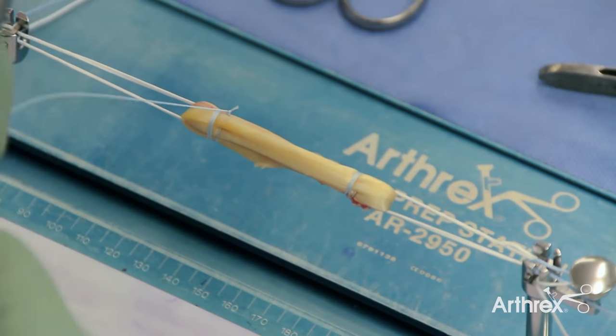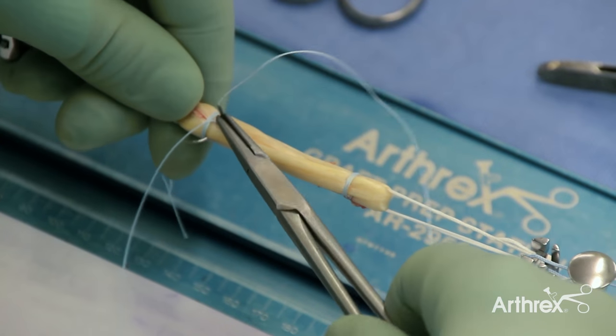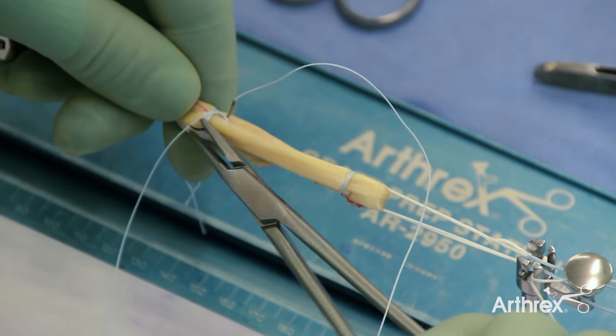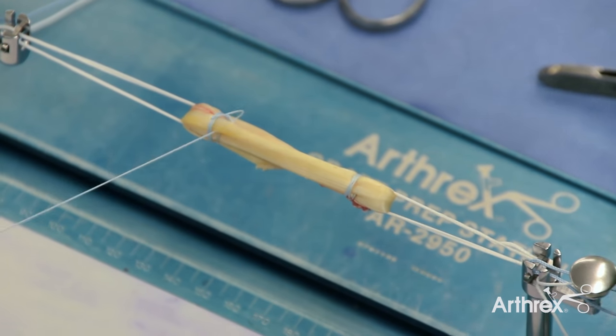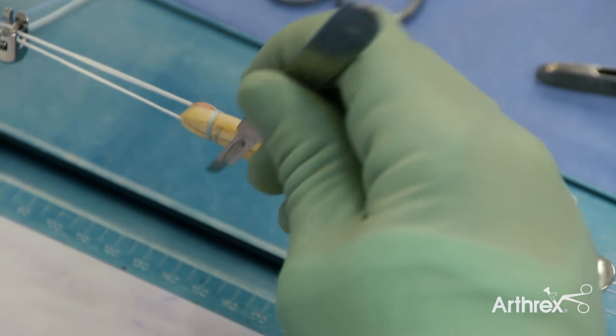Again we cut the short end and then bring the needle out through the central aspect of the graft, and this buries the knot. This is then cut flush.